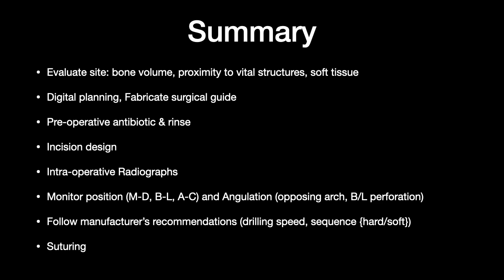We need to be cognizant that we're not perforating the buccal or the lingual plate while drilling. A lot of times we perforate the buccal plate, and we can graft, but perforating the lingual plate on the lower portion here is more serious, especially if there is a severe lingual concavity.